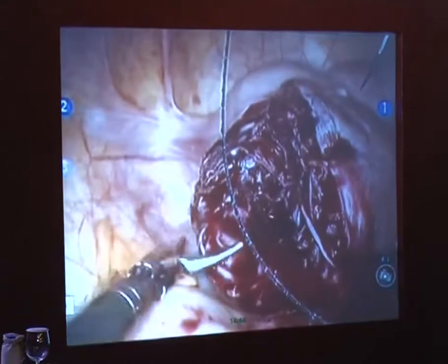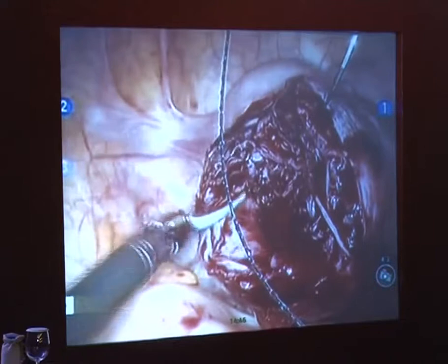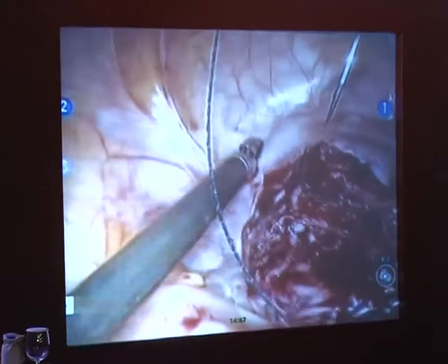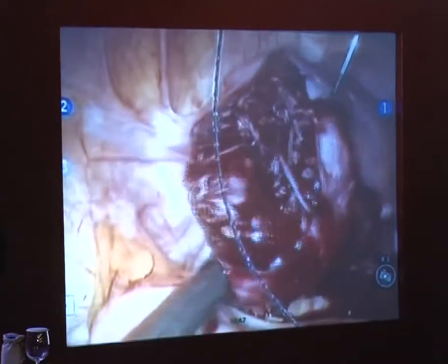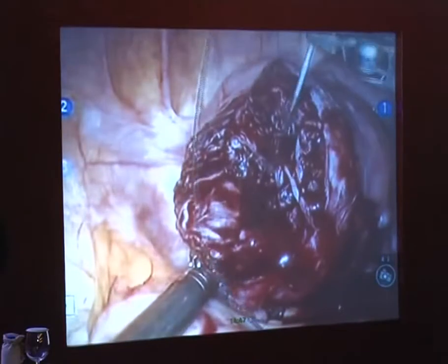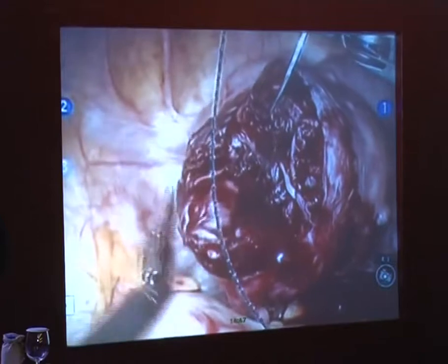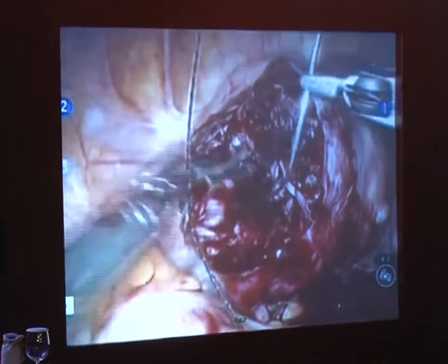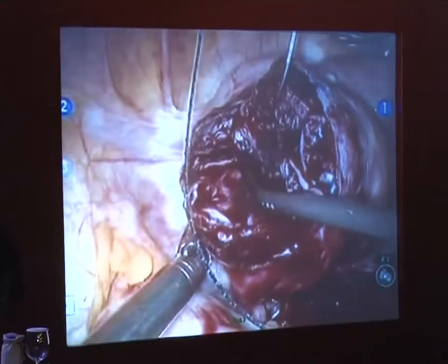Arnie, we were talking earlier about the grasping characteristics of the PK and the issues with it, and here you're suturing with it. Any comments about that? Yeah, I hate the PK for grasping. I prefer a long tip forceps. They don't have it. Prograsp would be a little bit too aggressive, and the fenestrated bipolar is also probably not the best at grasping. But in order to save money, I'm going to basically make myself use the PK. It's suboptimal. I don't normally use it, but I'm trying to save money here.